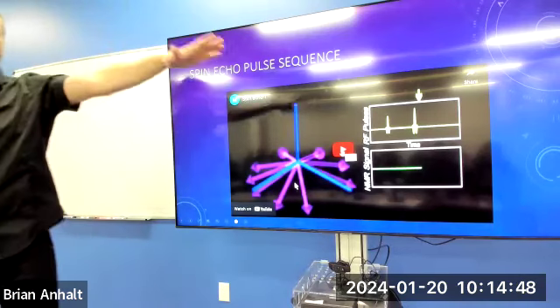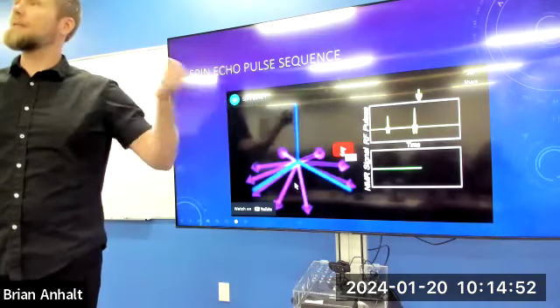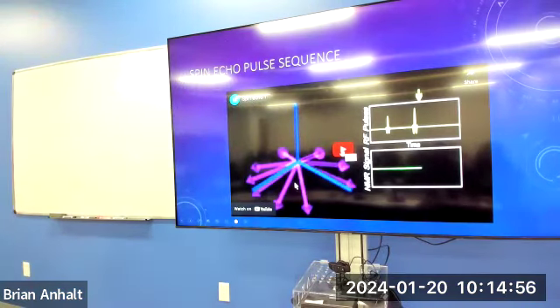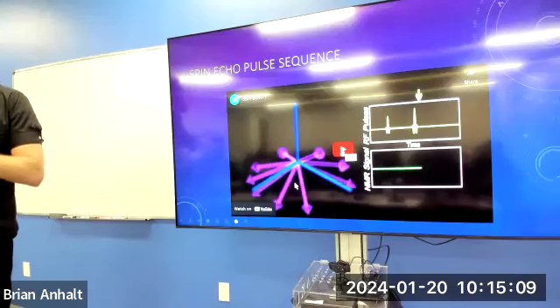That loss of transverse magnetization or phase coherence that is not due to spin-spin interactions is something called T2 star. The dephasing of protons that were pushed into phase, going out of phase because of magnetic susceptibilities and inhomogeneities, is something called T2 star.